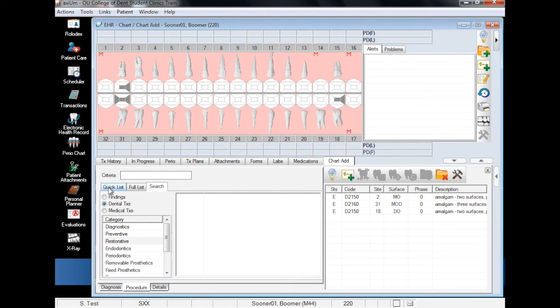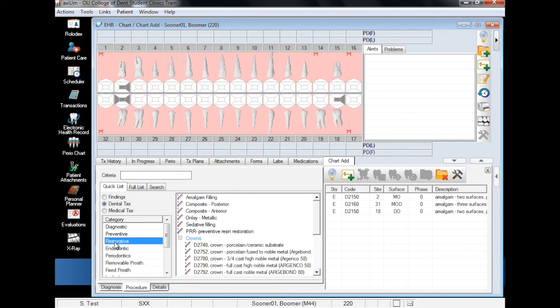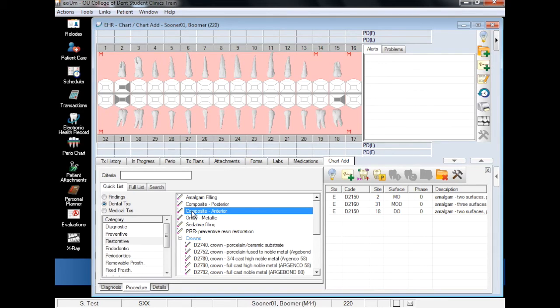Next, we will add composite fillings. Composite fillings are broken up into two categories, anterior and posterior. We will chart the anterior teeth first by clicking on the appropriate surfaces.